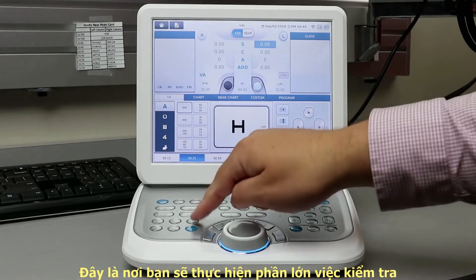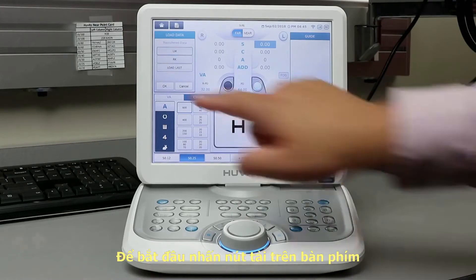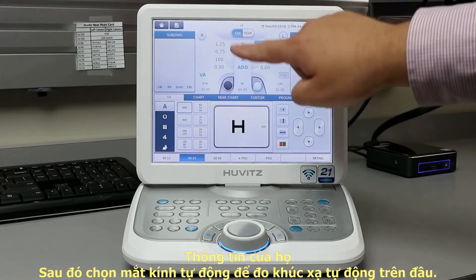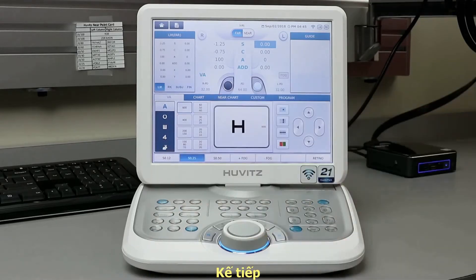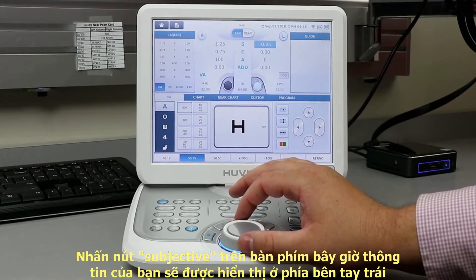To start, press the load button on the keypad, then select auto lens meter or auto refractor keratometer, and which patient you would like to begin with. Their information will be displayed here. Next, hit the subjective button on the keypad. Your information will now be displayed on the left-hand side. Use the dial to begin your refraction.